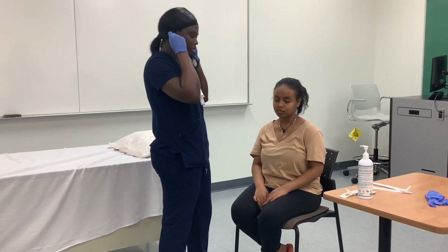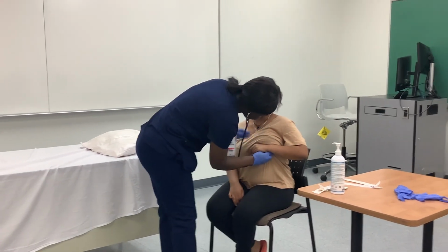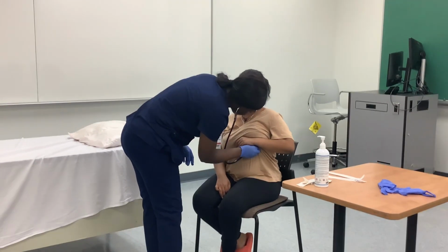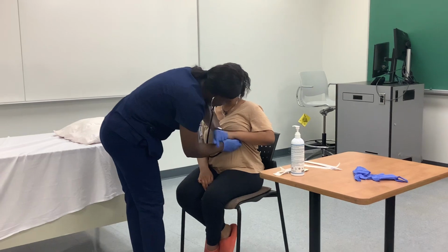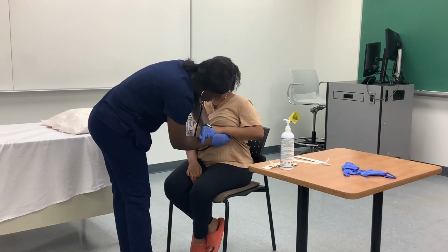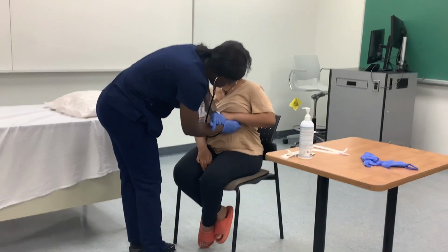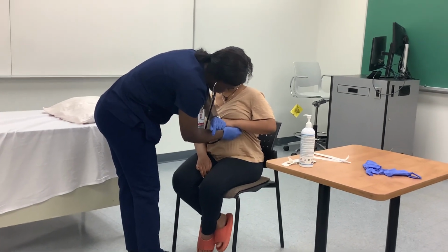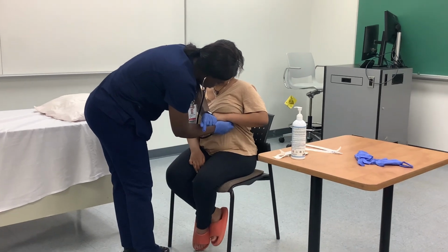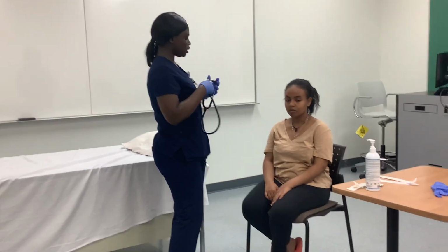Okay, I'm gonna auscultate the apical pulse for 30 seconds. So it is 64 beats per minute. It is 2 plus strong and it's regular.